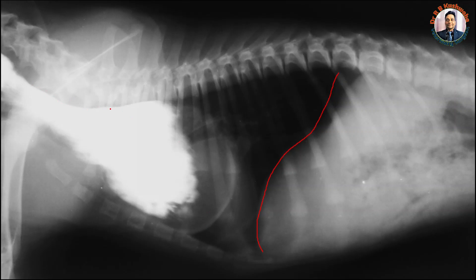But if you see here, this is a balloon-like structure. This balloon-like structure is nothing but the esophagus. This esophagus is dilated cranial to the heart. The radiopaque structure you see is barium sulfate, which we fed to the dog for contrast radiography, so that we can confirm that this swelling is the esophagus.